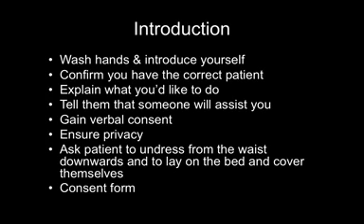So start off by washing your hands and introducing yourself to the patient using your full name and title. Confirm you have the correct patient by checking their name and date of birth, and explain what you'd like to do. Tell them that someone will assist you throughout this procedure and gain their verbal consent. Ensure the patient's privacy at all times, and ask the patient to undress completely from the waist downwards and to lay on the bed and cover themselves. If you're asked to do this on an unconscious patient, then it's important to check that the consent form has been signed before the procedure begins.